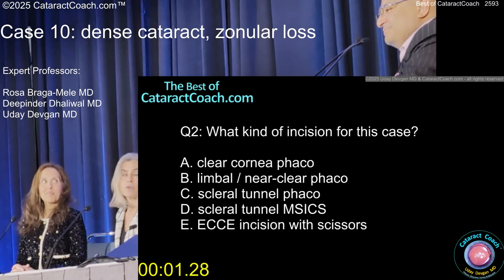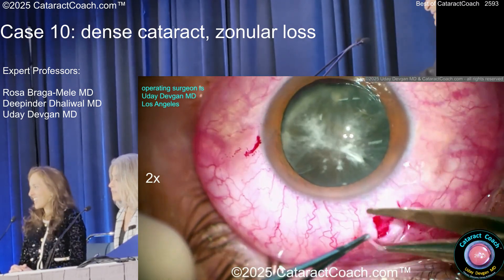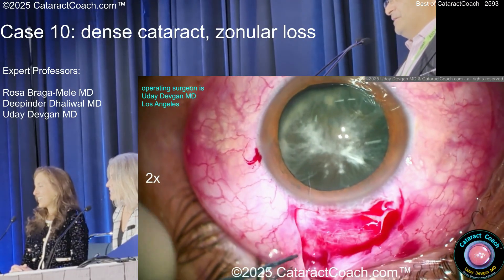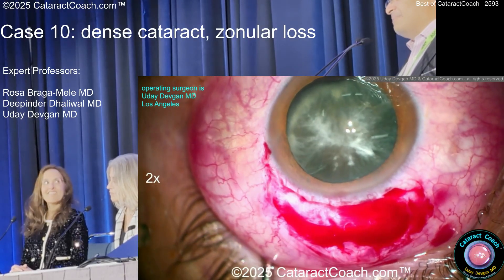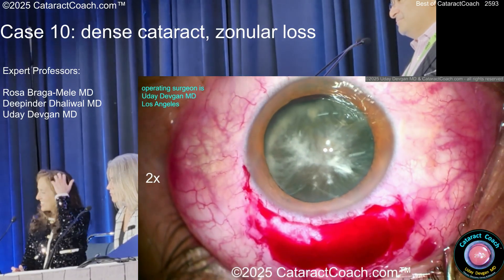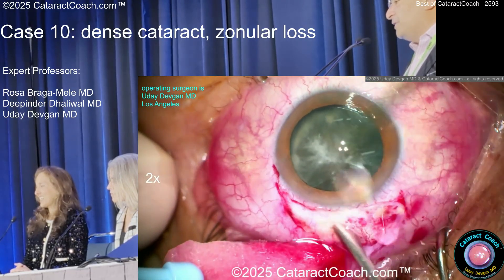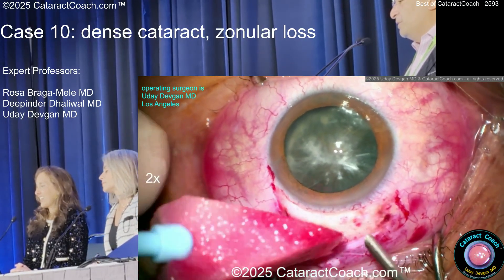I would do a scleral tunnel thinking I'm going to go through it and remove the whole nucleus. Following that advice — look how big I make the paracentesis because I think I'm going to convert. I'm doing MSICS right off the bat, not even trying phaco. No phaco here — cornea is reasonable, pachymetry 600, endothelial cell count 1600.